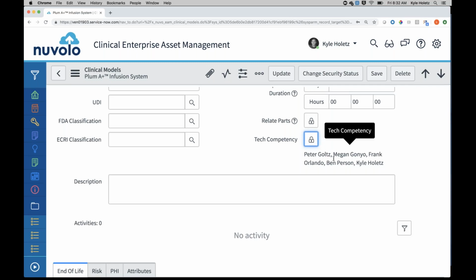So what you're saying then is you could have them complete 5 work orders and you call the OEM on all 5. So it is condition based, so we would be able to pull things like that out. If you have your service provider listed on the work order or anything like that, or a service-based PO against it, we could pull those work orders out. So it's just a simple formula.